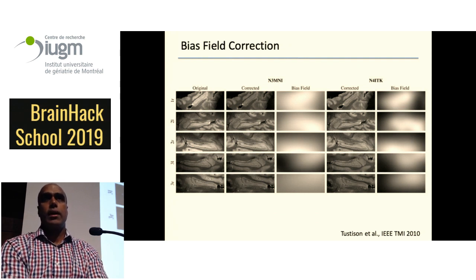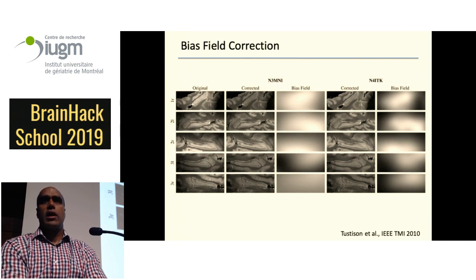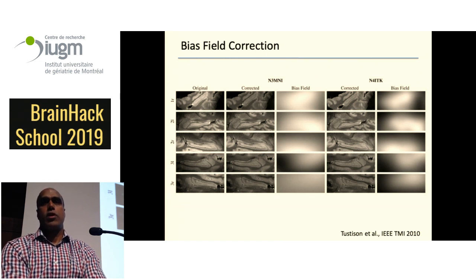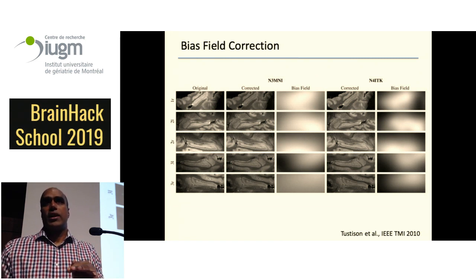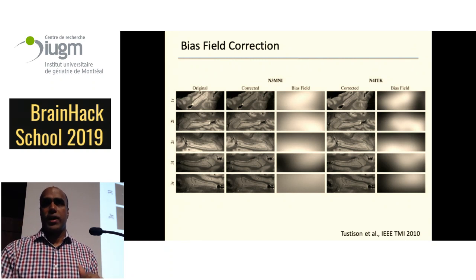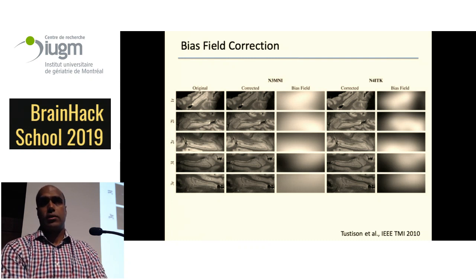We do a few things now where we actually do a pre-classification, which is quick and dirty, and we just constrain the N4 correction to the gray and white matter, because you don't really care about the bias field in big ventricles, for example, right? You really want to concentrate your focus there. And we found that really helps us a lot too.